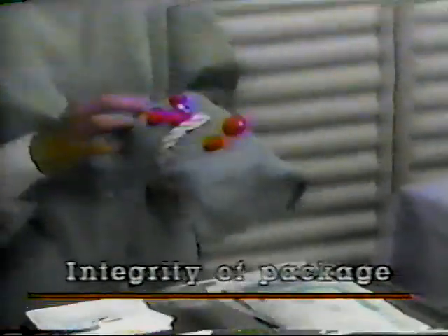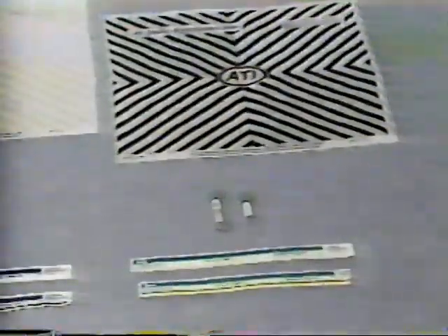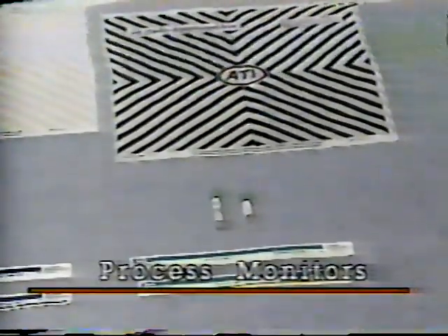Always check the following before opening a sterile package: the integrity of the package, the expiration date, and the sterility process monitors. Principle number 2. A sterile barrier that has been permeated must be considered contaminated.